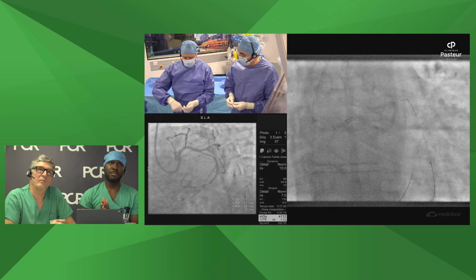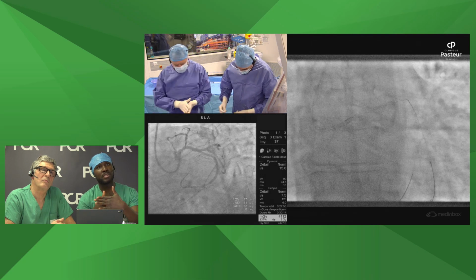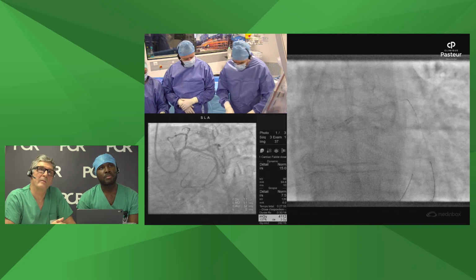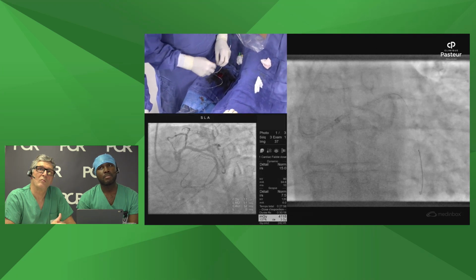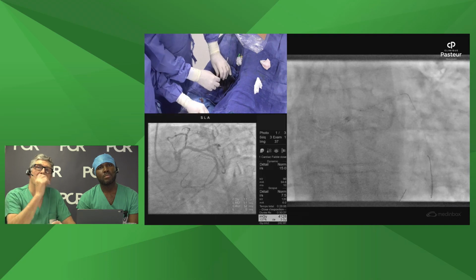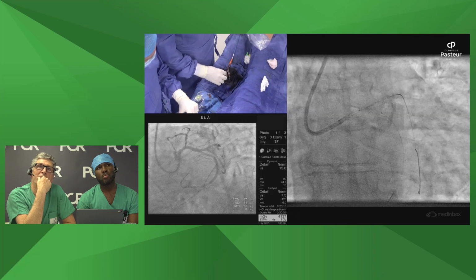The choice of the diameter of the balloon is according to the length or the diameter of the left circumflex, or not? True. Yes. But 3.5 is certainly too small. Yeah. But we take a 3.5 just in order to pre-open the struts, and after that we will move with the 4.0. If we take the 3.5, you see, it's easy. It's easy because you have done the POT, and because we have done the POT, you went through a distal strut. So it's usually very easy.